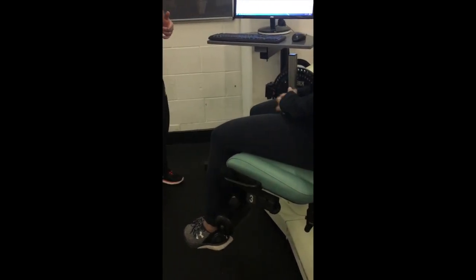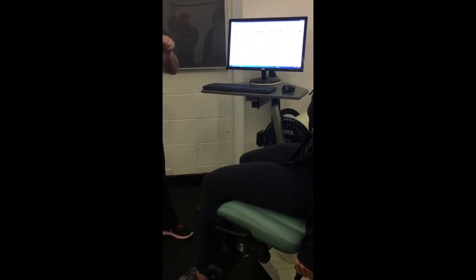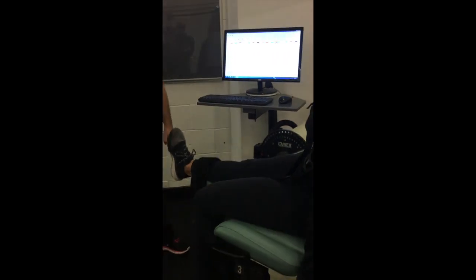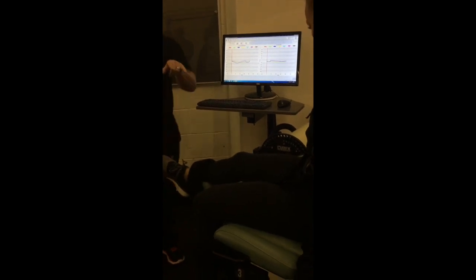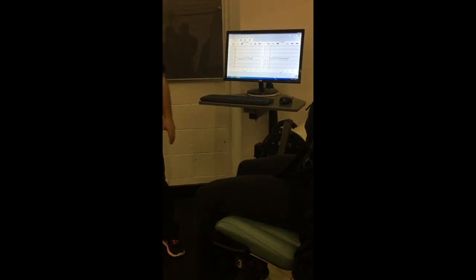Okay, so if you straighten your leg out, the moment it hits 0, okay? Right, so this is eccentric, so you're going to have to pull, and then push. Pull, and that's hamstrings, push, and that's quads. So you do the opposite, keep going. Oh, that's it. Oh, I didn't go forward. And it won't let you, you have to move through full range, so you've done 2 reps there. And this is why if you're doing eccentric contraction, you do your practice session, and you do your trial reps. That's it.